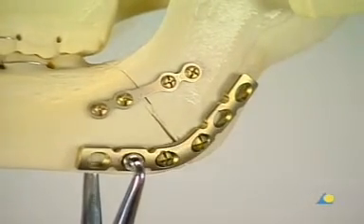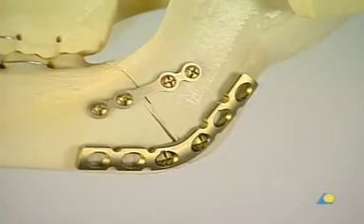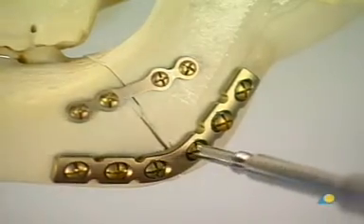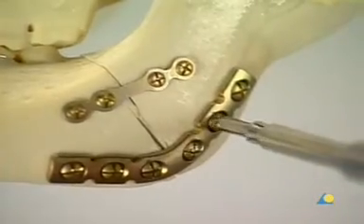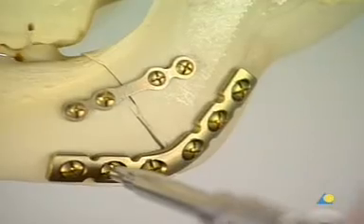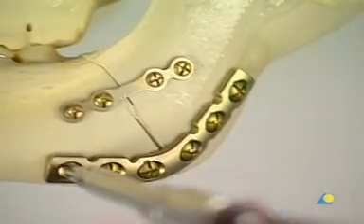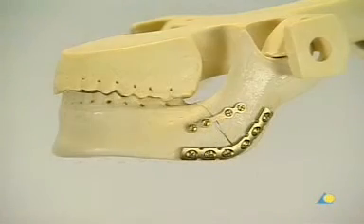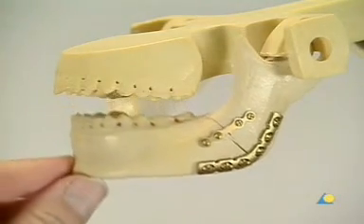If the plate-holding forceps was used, it should now be removed. Neutral screws are inserted into the remaining plate holes and all the screws are tightened. The Ernst ligatures are removed. The mandible is now functionally stable.